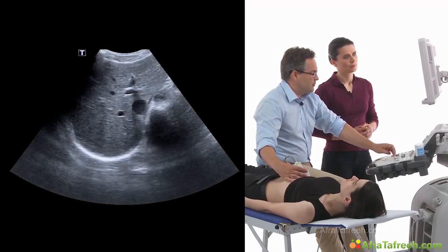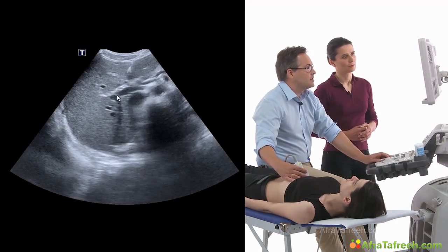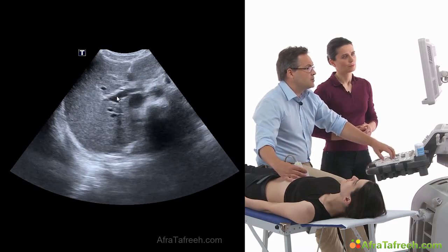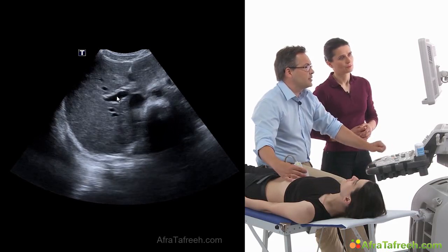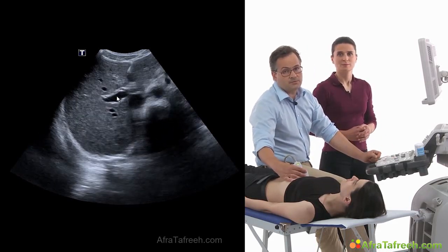There are vessels seen in this picture, and they have to be black and echo-free. And so I have to reduce the gain. I think this would be fine. Yes, and echo-free structures are really black on the screen now.